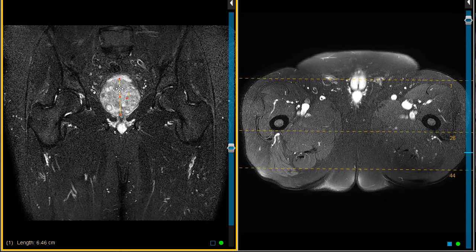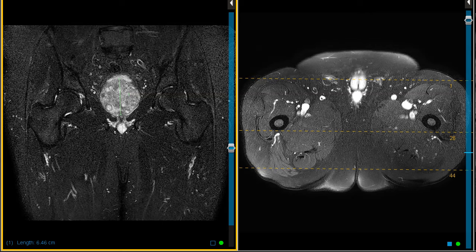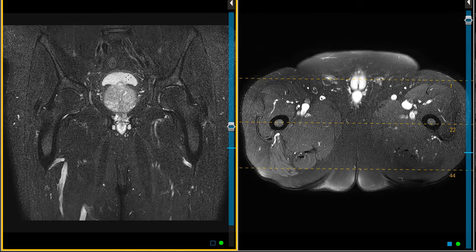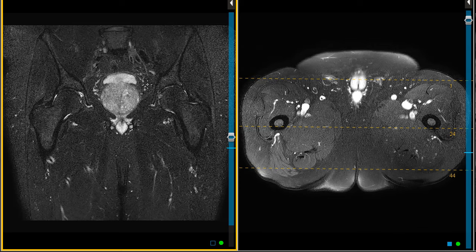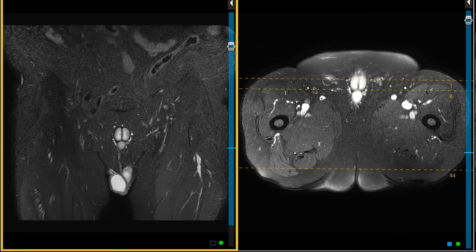We can see the same finding on another view with a larger field of view. You'll also note this big prostate gland — another incidental finding. He's got a large heterogeneous signal intensity prostate gland that elevates the bladder floor, and this looks just like benign prostatic hypertrophy, or BPH.